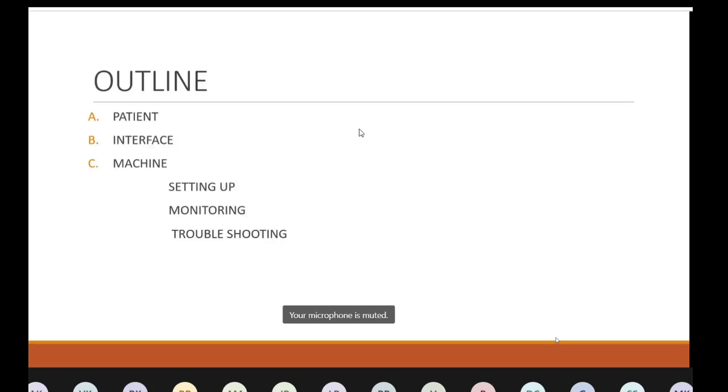For a BiPAP machine, the terminologies that we use are important because there are a lot of confusions. So if you're using a portable NIV or a BiPAP machine, the expiratory pressure we give is called an EPAP, and the inspiratory pressure that we give is called an IPAP.